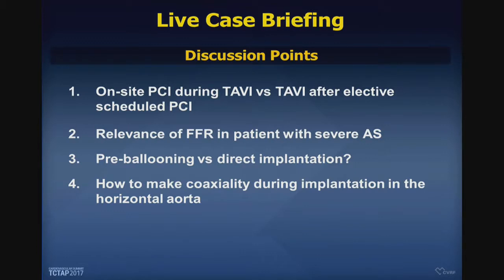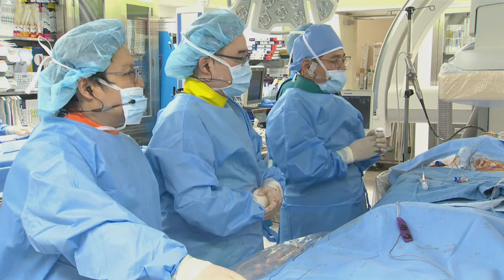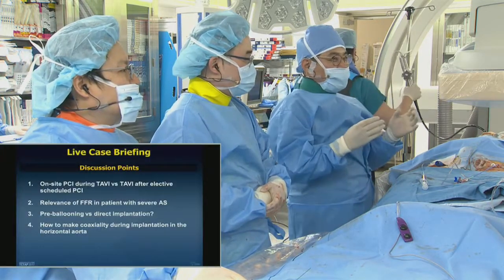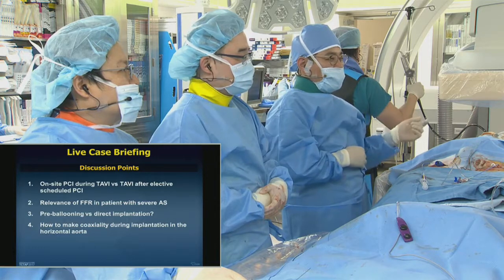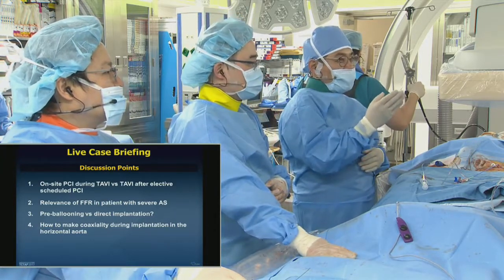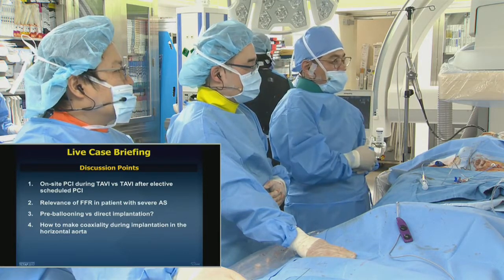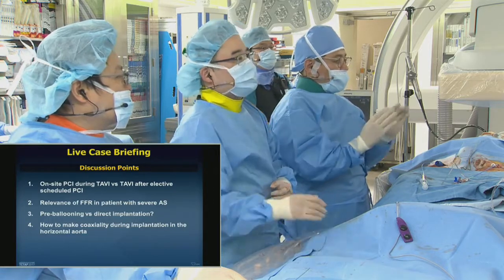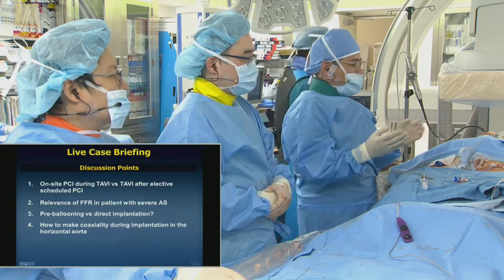Before the procedure, we were planning a minimalist TAVI procedure. However, the patient has a lot of calcium in the right coronary cusp and non-coronary cusp. So we changed our policy because we are concerned about paravalvular leak after implantation. So right now she underwent general anesthesia and TEE was inserted. In this patient, two points: can you believe FFR in a patient with severe aortic stenosis, and do you prefer pre-ballooning in a patient with severe AS who is going to receive the Evolut R, not Sapien 3? So my discussion points are like this. Please, panel discussion, and let me know.